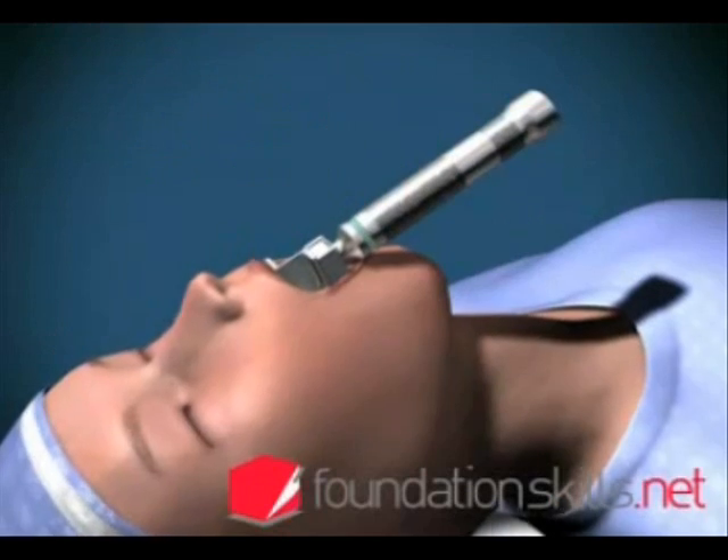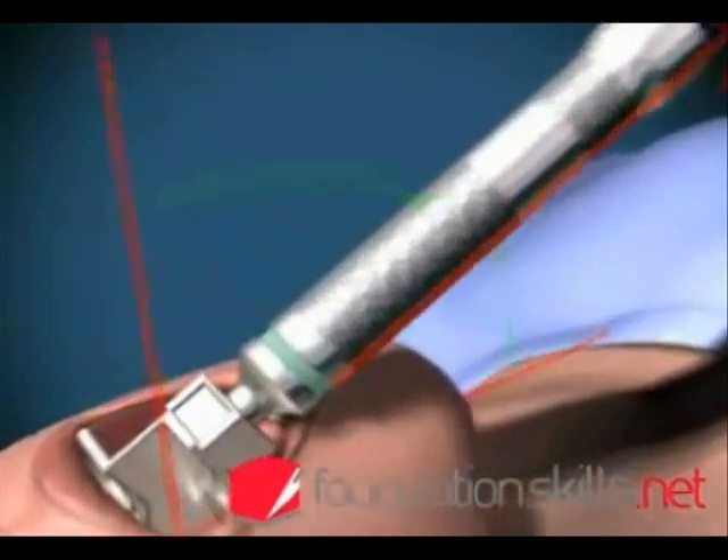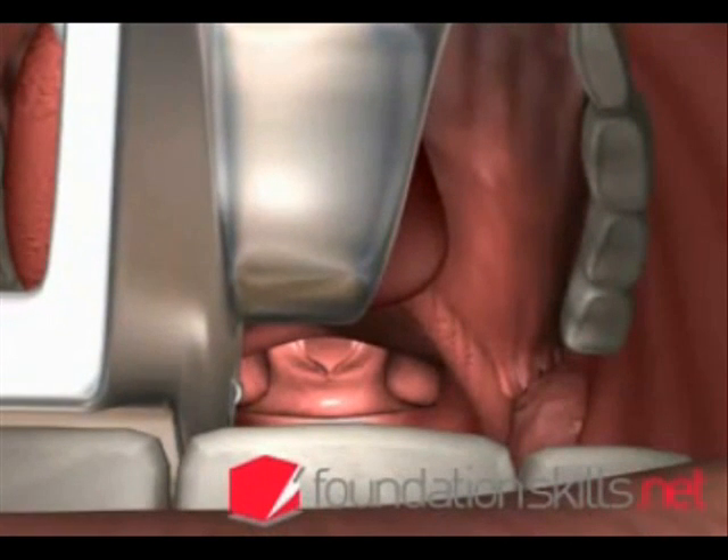With the handle of the laryngoscope pointing away from you at 45 degrees, lift upwards to lift up the tongue and epiglottis to display the vocal cords and the laryngeal opening.